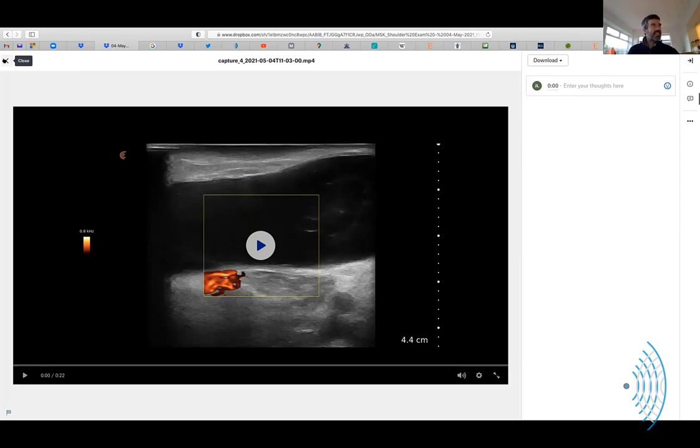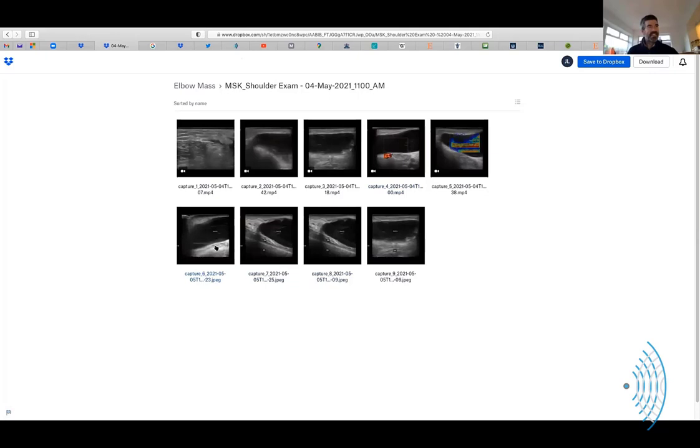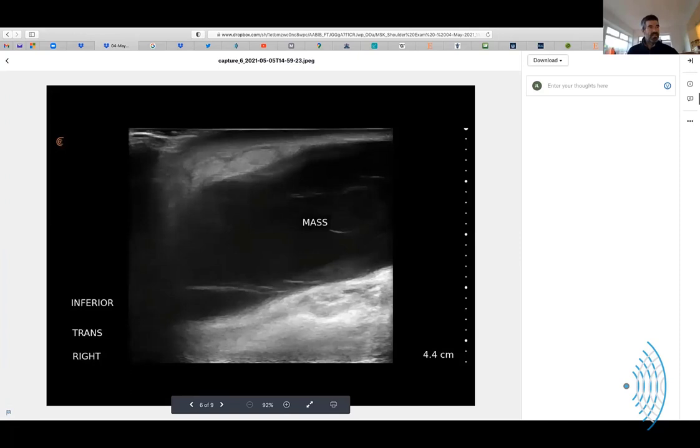Some of my takeaway pearls from this is that when you went over this, your eyes locked in on it not being completely formed as a round shape. You found that edge, and it was with confidence that you said this is a blood product, or at least this is what has flowed in there. So it's not something that's built up over time in an enclosed space and just stretched. It has flowed in. Yes. That's how it ends up creeping through here.